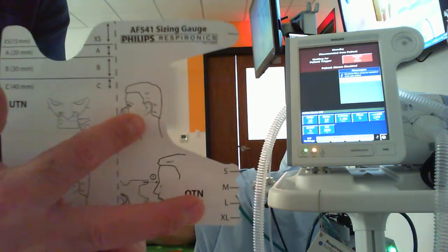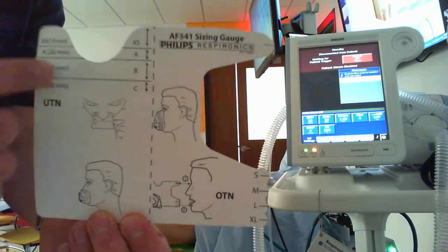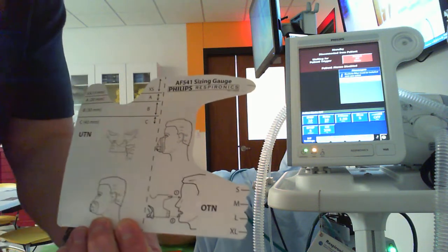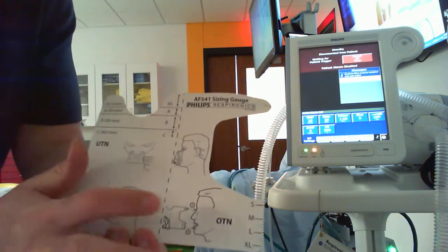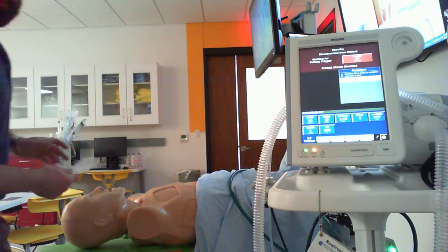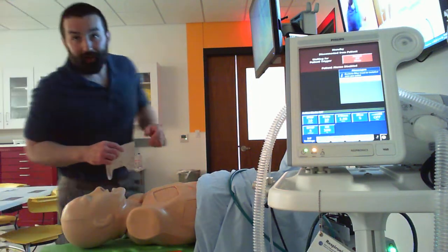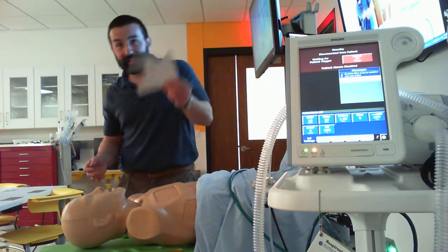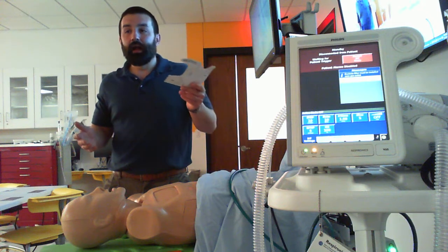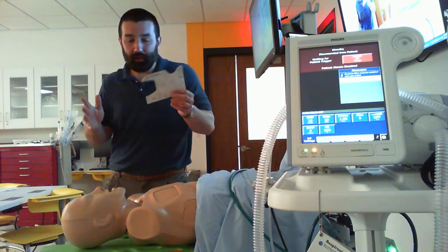What I'm going to do, I'm going to hold this sizing guide up, okay, and it shows you we're going to try and go from the top of the bridge of the nose pretty much down to this little cleft of the chin, okay? You don't want it too close to the lip, you don't want it proceeding down and past. In real life, we're going to end up doing more of an estimate on something like this, because I don't want to just stick this onto this patient's face and then, oh, that didn't work, all right?